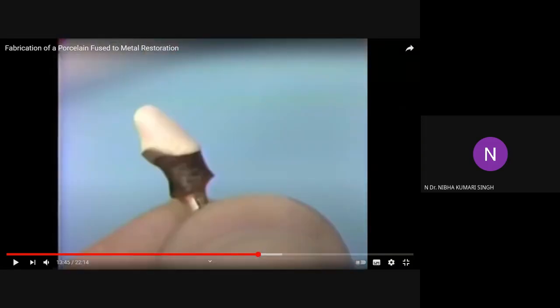After the firing is done, it looks somewhat like this, with a chalk-like appearance. After body or dentin porcelain is applied, you have to apply the incisal porcelain. Incisal porcelain is responsible for giving translucency to the crown, which will reflect the light. Otherwise, if you do not apply incisal porcelain, it will be chalk-like, more opaque and more porous.